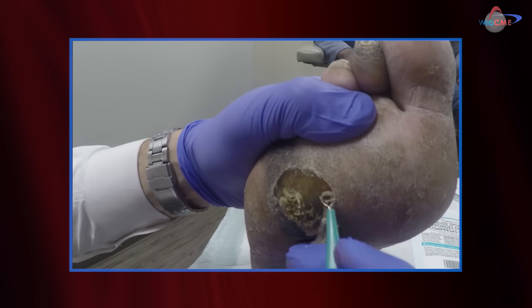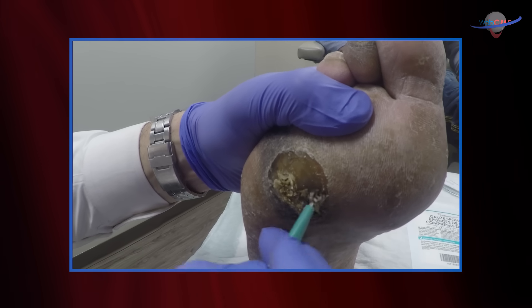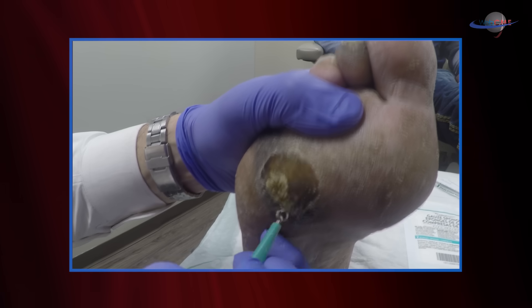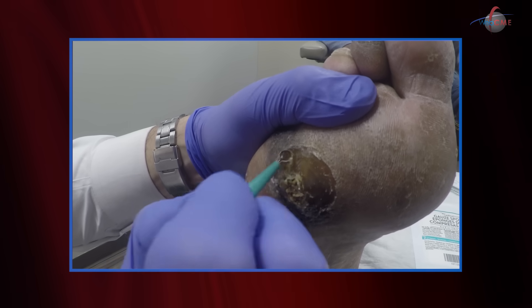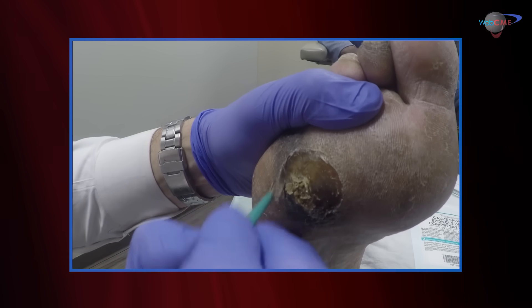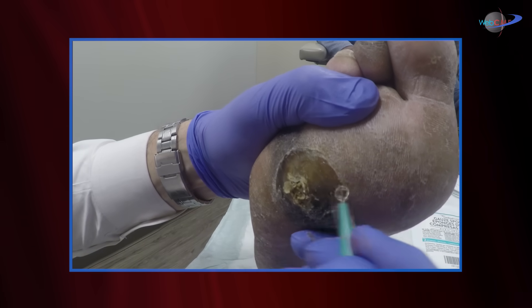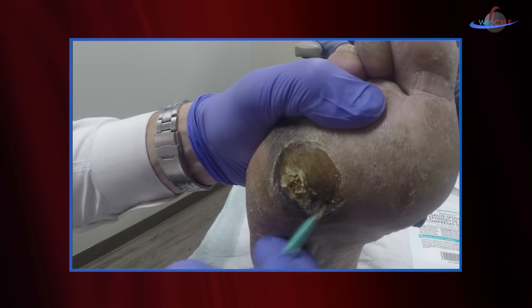We start at the margins, and what I need to do is determine the extent of the ulceration, the depth, and the amount of undermining, if any — and if there's an ulcer formed underneath. I like to deal with the tip of the iceberg first: the external margins, the callus on the margins, slowly taking this down, and then I work my way centrally to further define the ulcer.